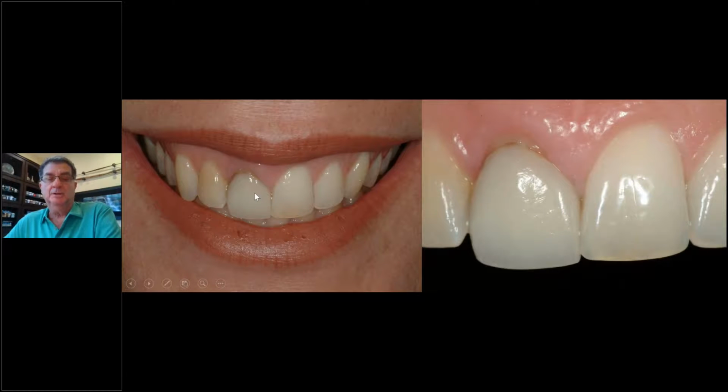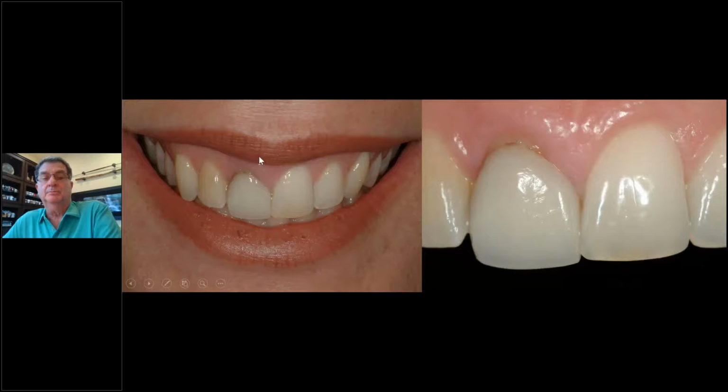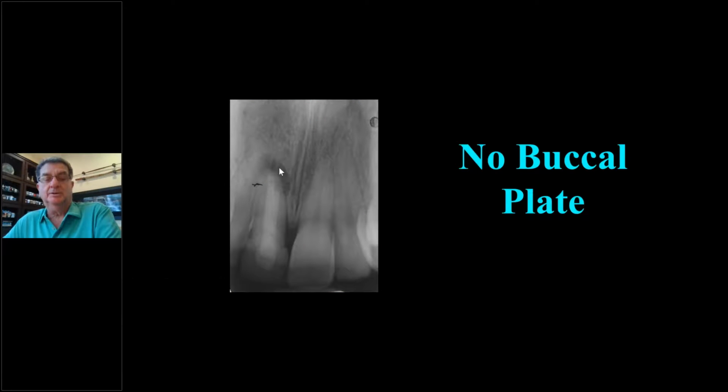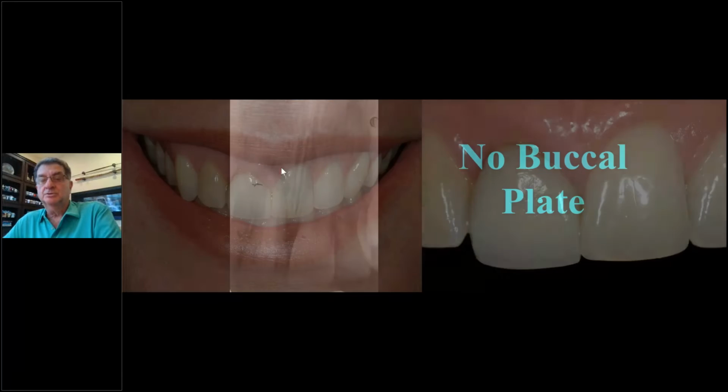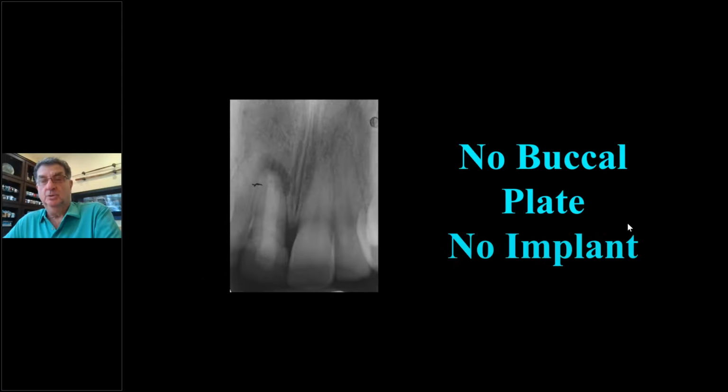I'm not going to do an immediate here because the buccal plate is gone. It looks like I should be able to do one, but the buccal plate is gone. It doesn't mean you can't do it with some, but I don't know where that buccal tissue is going to wind up. This woman had, I could probe this all the way up. Here's the infection. So when I have a high smile line like this, I still live by no buccal plate, no implant. No buccal plate, no implant. Not in the case where you see that gingival margin.